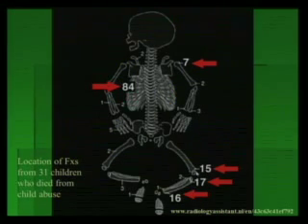The hallmark for child abuse is the metaphyseal corner fracture. The most common places for metaphyseal corner fractures are around the knee and around the ankle. Long bone fractures are very common, but they're not specific. If it's a 2-month-old and they have a femur fracture, that takes a lot of explaining. How did that 2-month-old that doesn't move get a femur fracture or a humeral fracture? But if they're a 14-month-old or 15-month-old toddler, they can get fractures, but the metaphyseal corner fractures are what you really look for. The posterior rib fractures, you look for those.